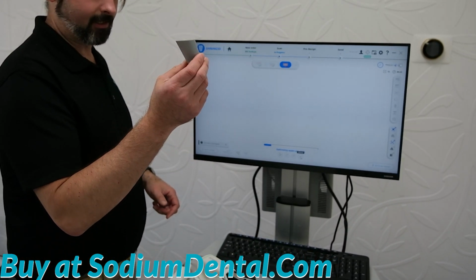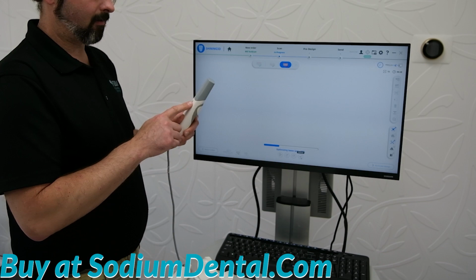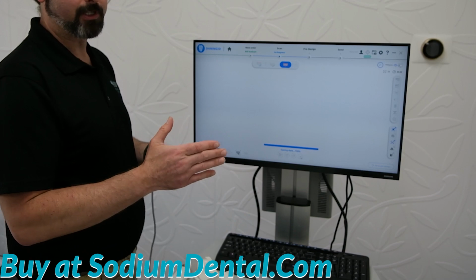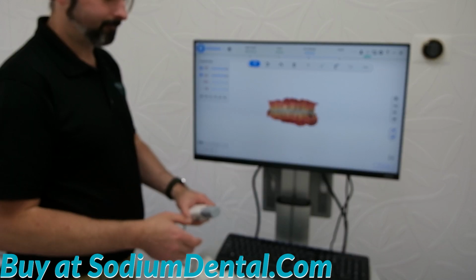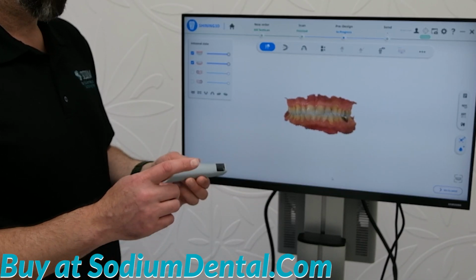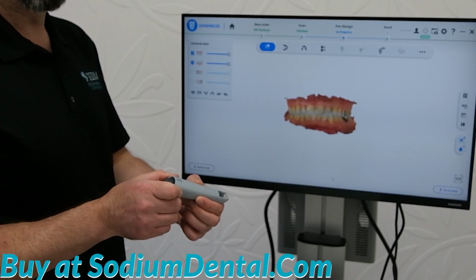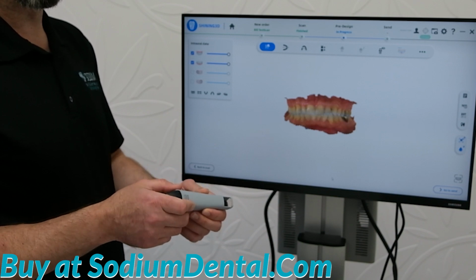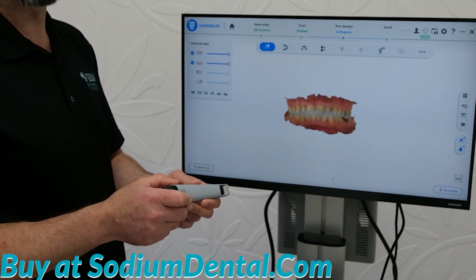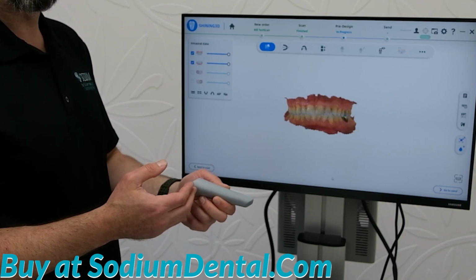Always return your dust cover to the scanner when you are finished scanning. This will protect the lens, keep dust off of it, and give it some protection from bumps and damage. Your scan tip should have a cotton ball placed on the mirror, then be put into a bag for sterilization. Follow the sterilization instructions in your laminated sterilization instruction cards to get the most number of uses from your autoclavable scan tips.